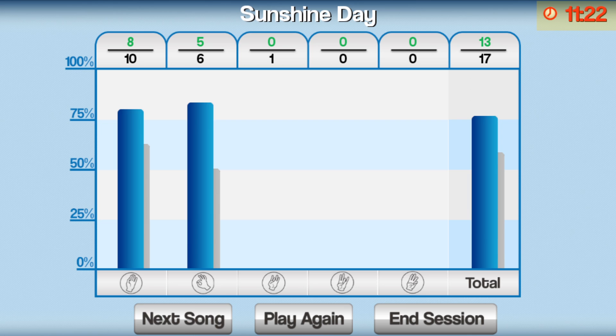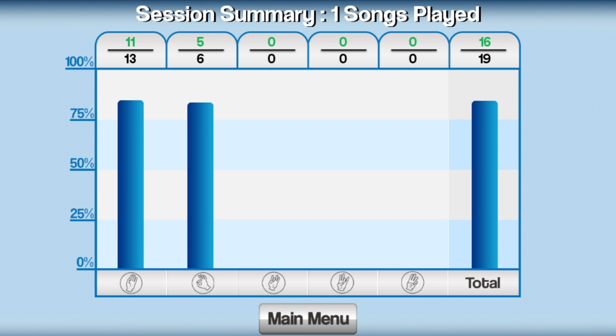The clock in the top right corner displays the time remaining in the session. Select End Session to bring up a summary screen that shows the cumulative performance for the current session.